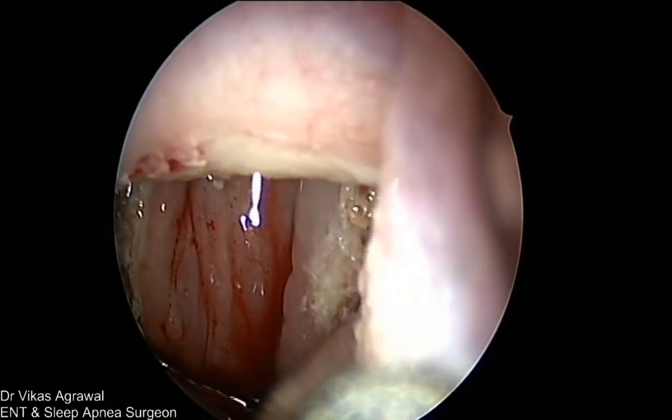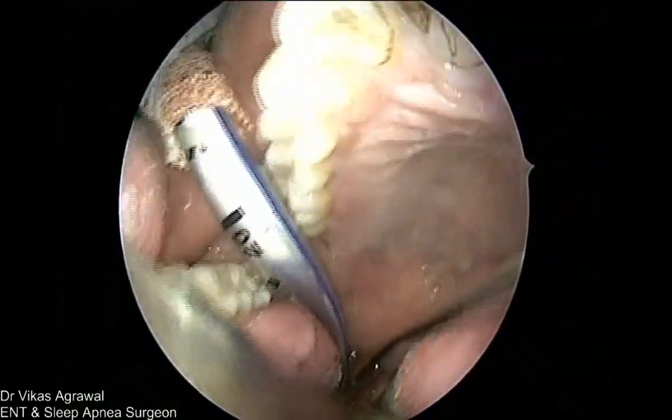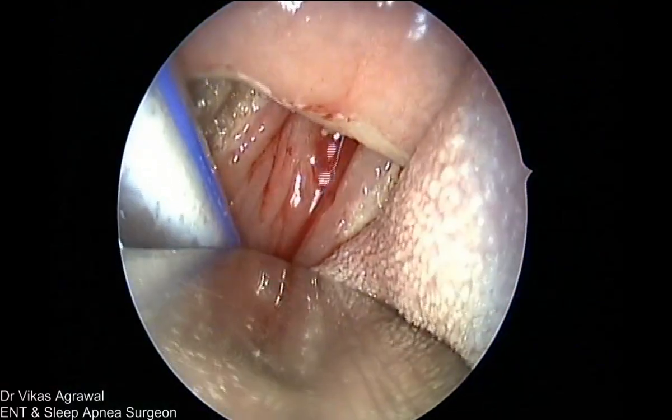Okay. So there's just a little trickle from the top, which will stop in a few seconds. Show the light inside. I want it bone dry before Kalpesh extubates. Okay. I want it to become bone dry before he extubates.